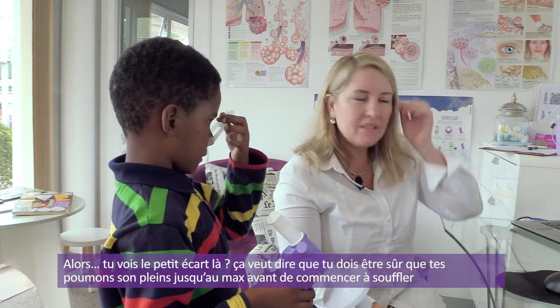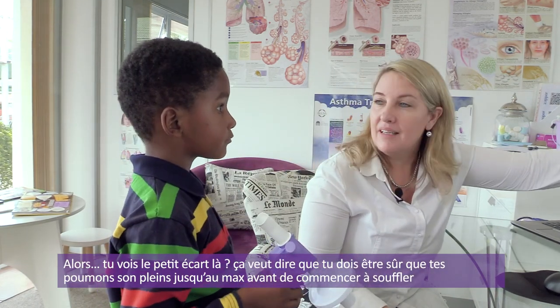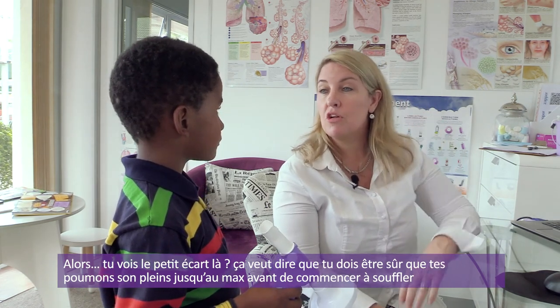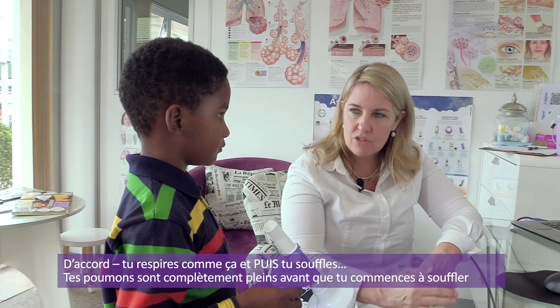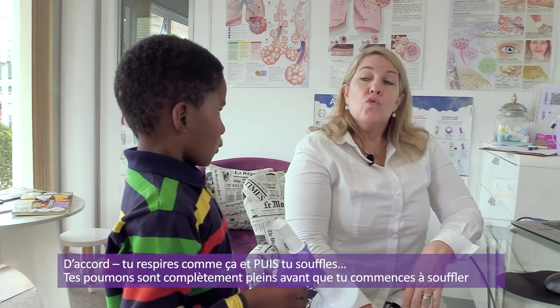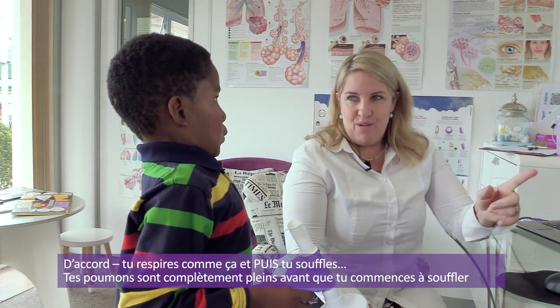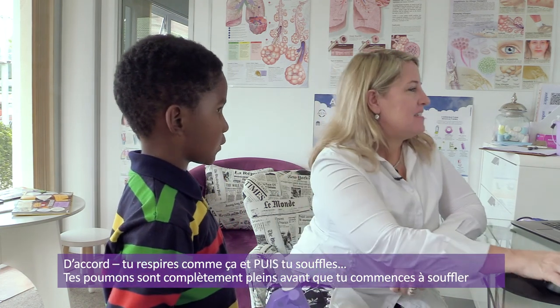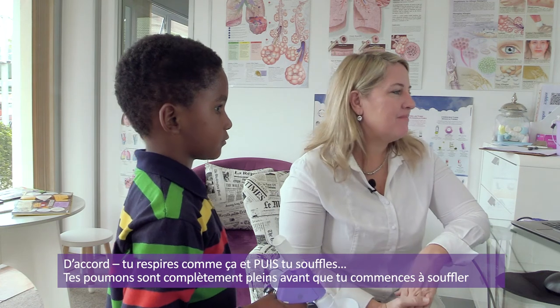Excellent. Okay, take your nose clips off. Okay, you see that little difference there? It means that you've got to make sure your lungs are full, full, full before you start to blow. Okay, so go like this. And then blow. So your lungs must be very full before you start to blow. All right. Okay, you can put your nose clips on.